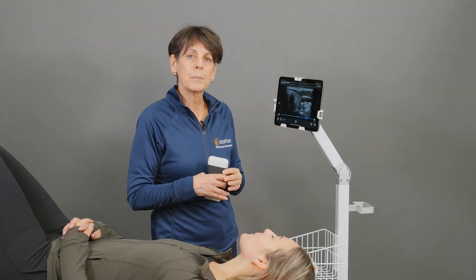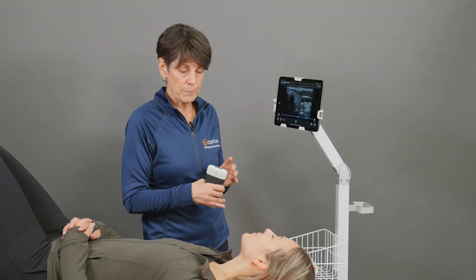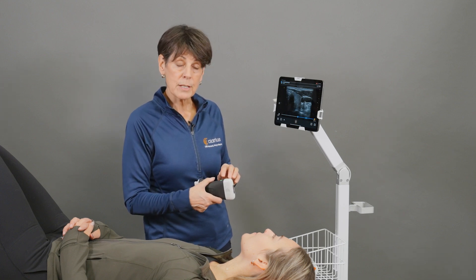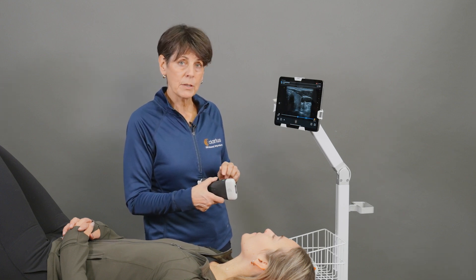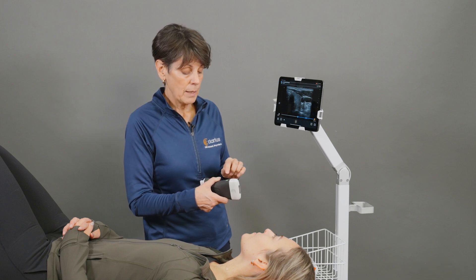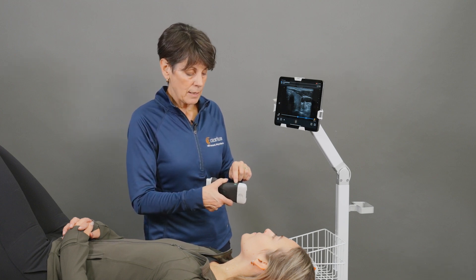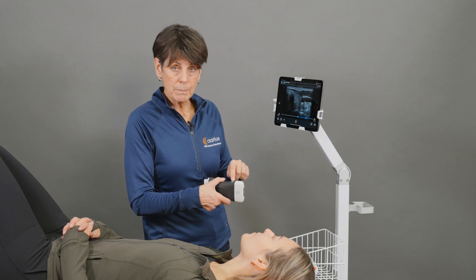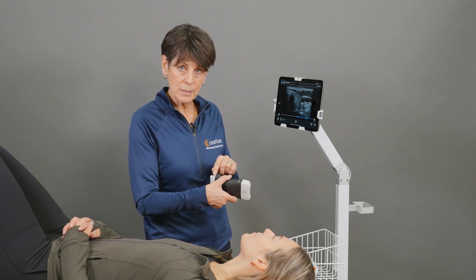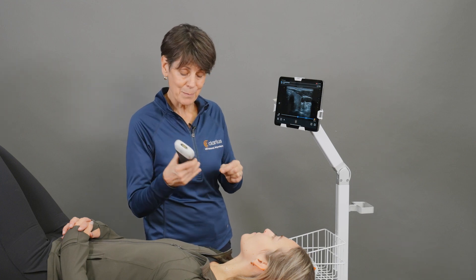The other thing we'll talk about is the orientation of the scanner. Every scanner, regardless of manufacturer, is going to have one or two indicators on one side of the scanner. It'll either be a light, as it is in this case, it may be just a dot, or it may be a tactile nubbin on one side of the scanner that doesn't exist on the other.